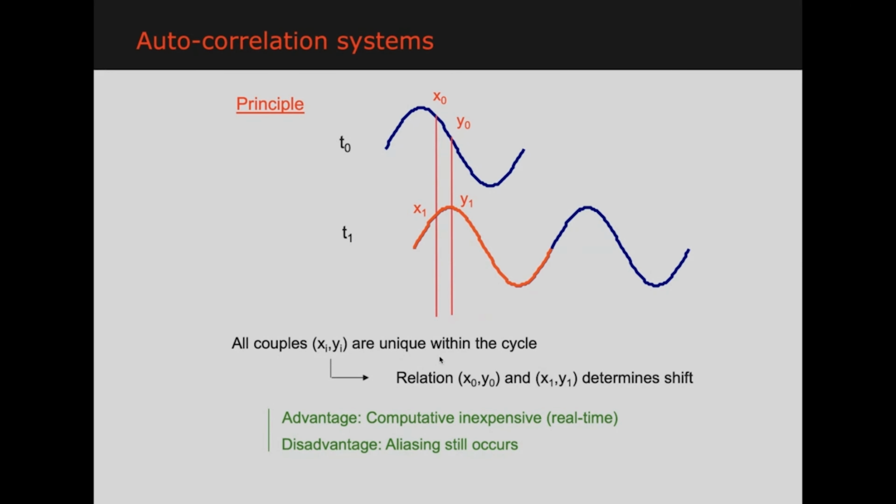Now, one thing which is important is that if the reflection of the second pulse has shifted more than a wavelength, we cannot distinguish that anymore from less than a wavelength, because it's periodic. Every time it shifts a wavelength, we don't see anything anymore, or if it shifts a wavelength plus a little bit, we can't discriminate whether it was shifting a little bit or shifting a wavelength plus a little bit. This is what we call aliasing.